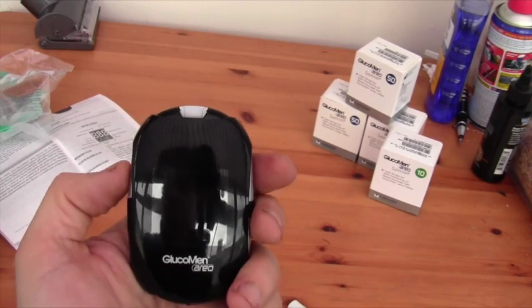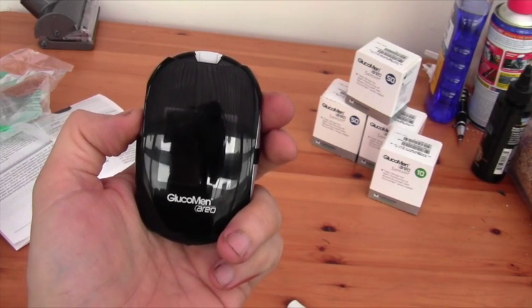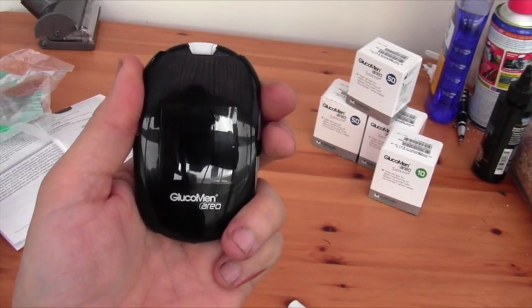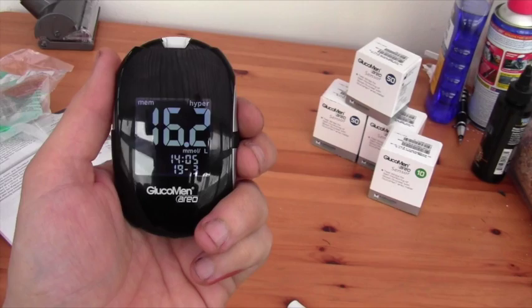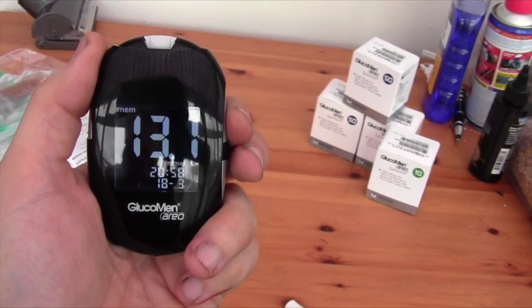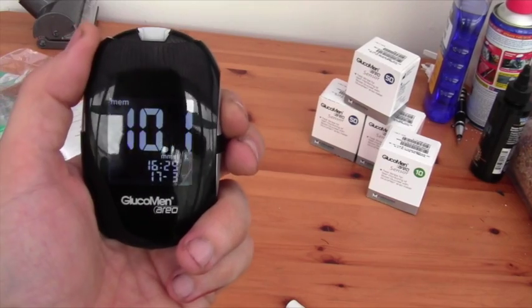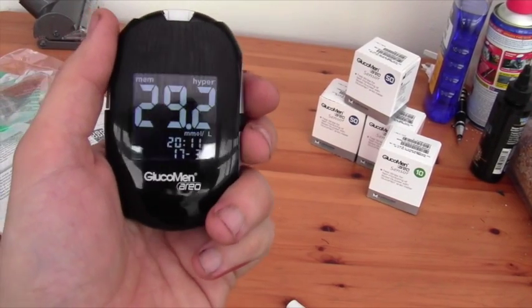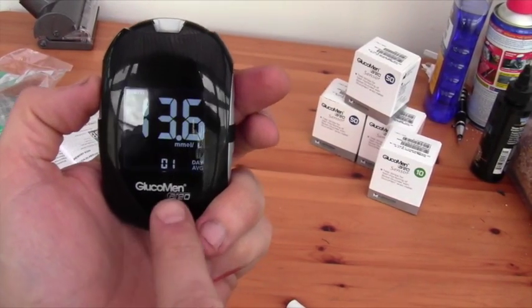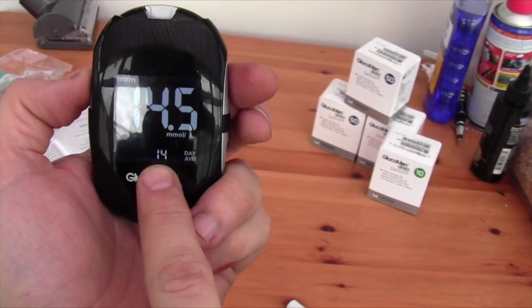You can go back and review your tests. Press and hold the power button for about a second just to bring the meter on. You can open up memory and use the up and down arrows to scroll through your recent readings. Unlike some meters, it can read above 27. By pressing the power button again you can get your one-day average, seven-day average, and fourteen-day average.